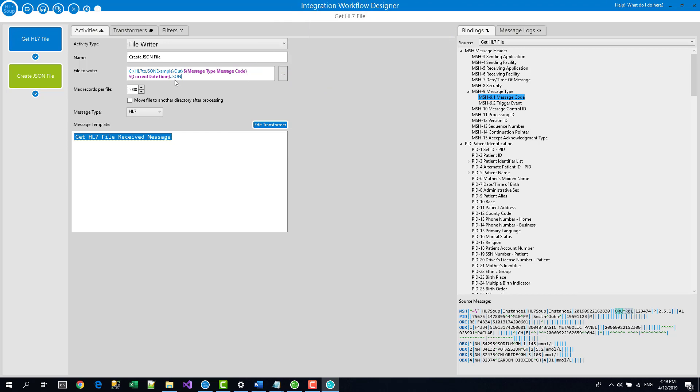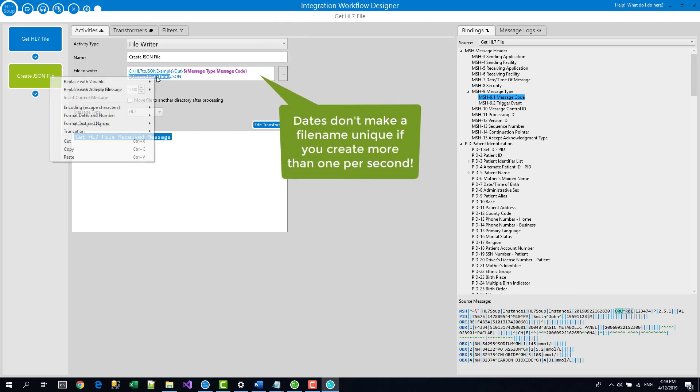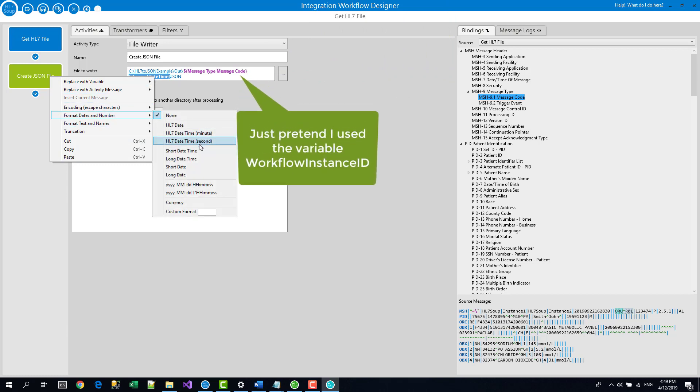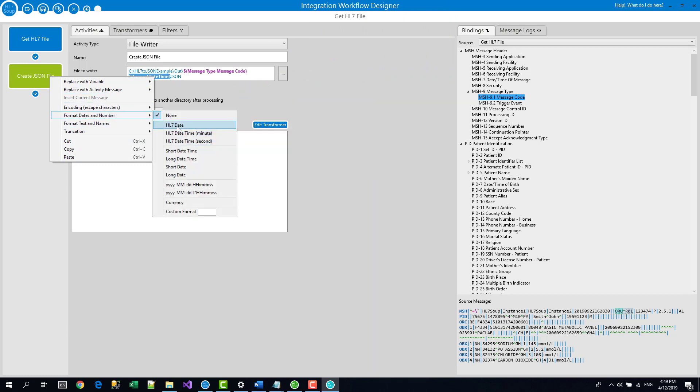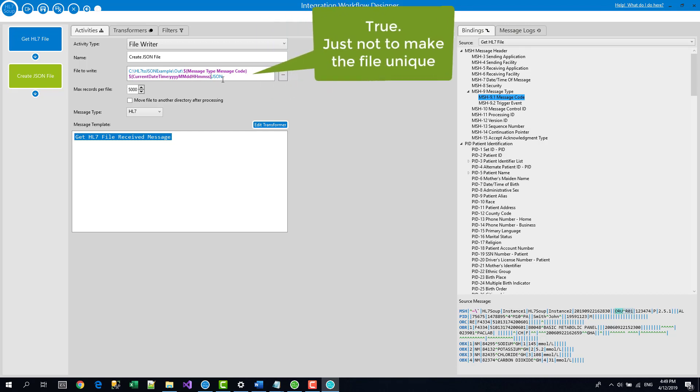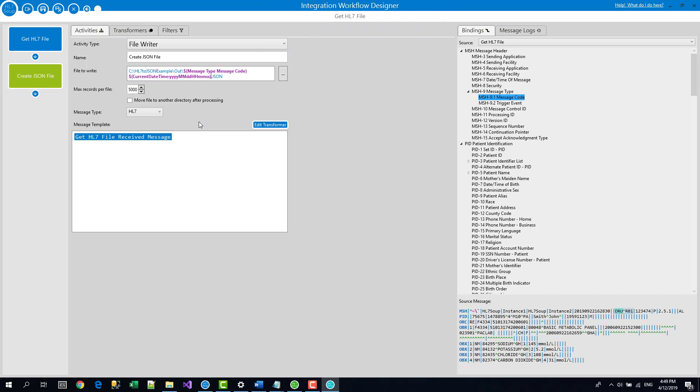And then just to make it unique as well, I'm just going to right click on it and say insert the variable and I'm just going to put the current date time in as well and then dot json. I just also want to give that current date time a specific format. Actually the HL7 dates are really good for that format, that file format is really good for writing out file names because it's got no funny characters in it. So we'll just use that. Terrific.